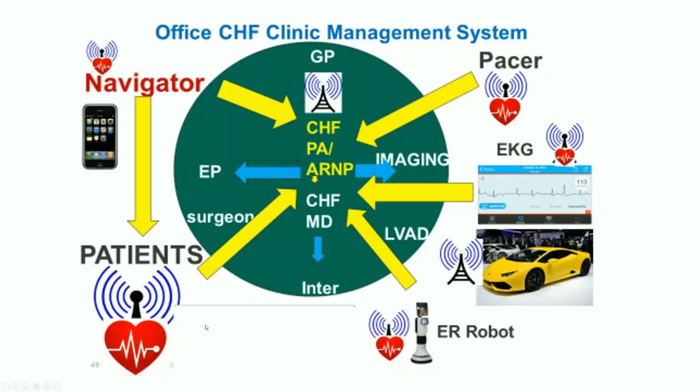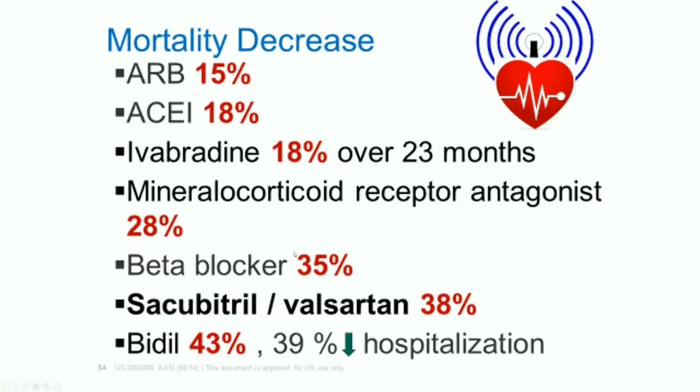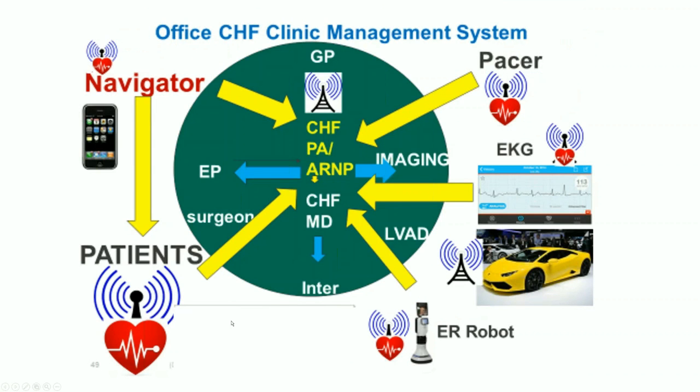And then hopefully at some time we will get something called CardioMEMS, which is not available right now because of the pricing. But I've got this blank spot here for plugging in CardioMEMS. So we'll be able to get the PA pressure sent to us from the patient's heart by a sort of pillow into our system by email, and we'll be able to contact that. And then the nurse navigators have their iPhones and they have contact.